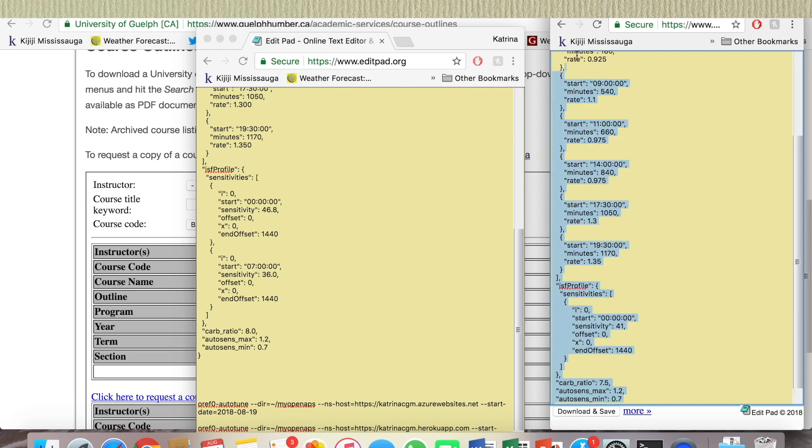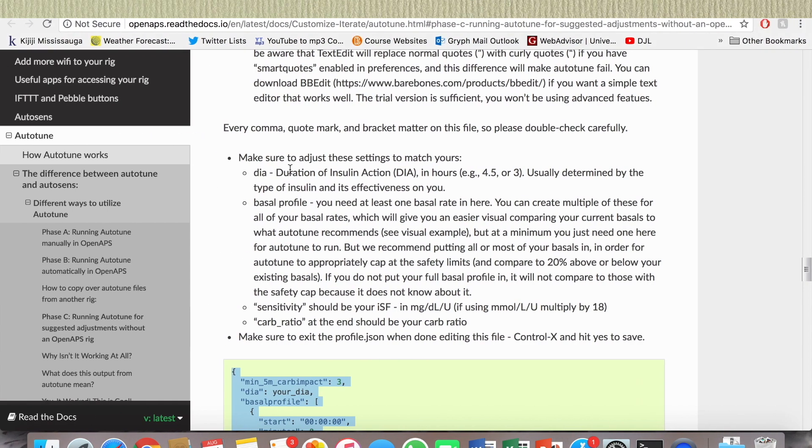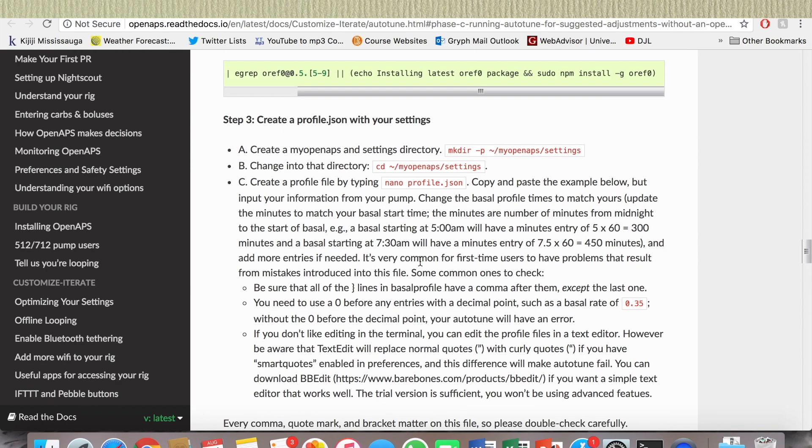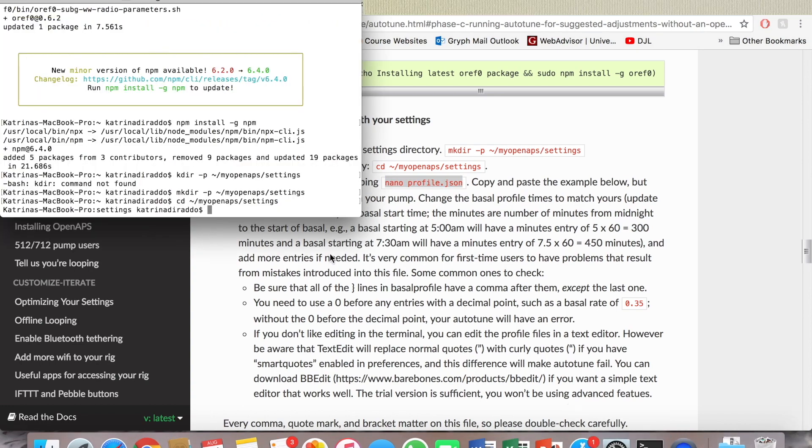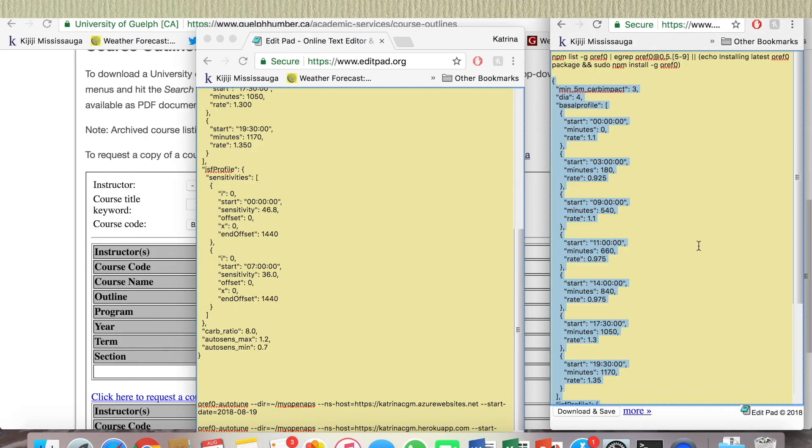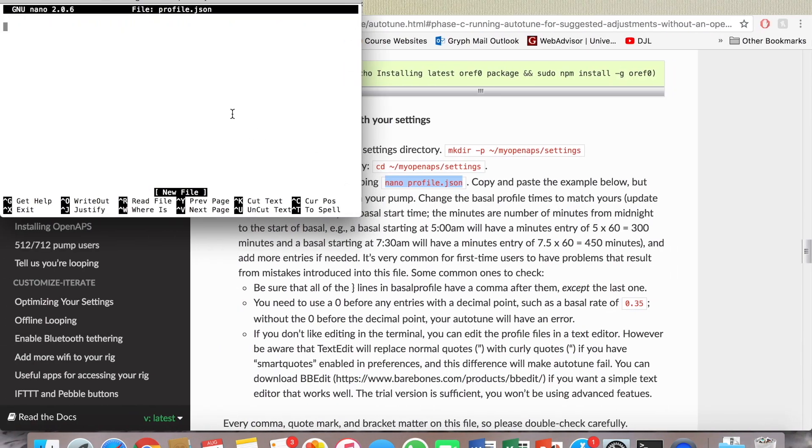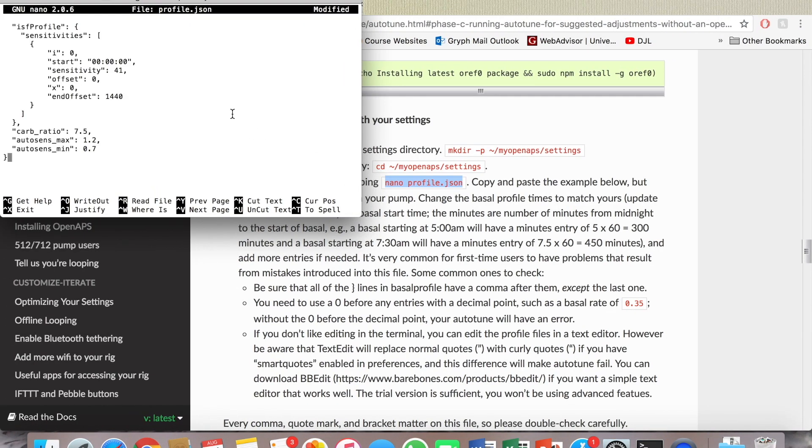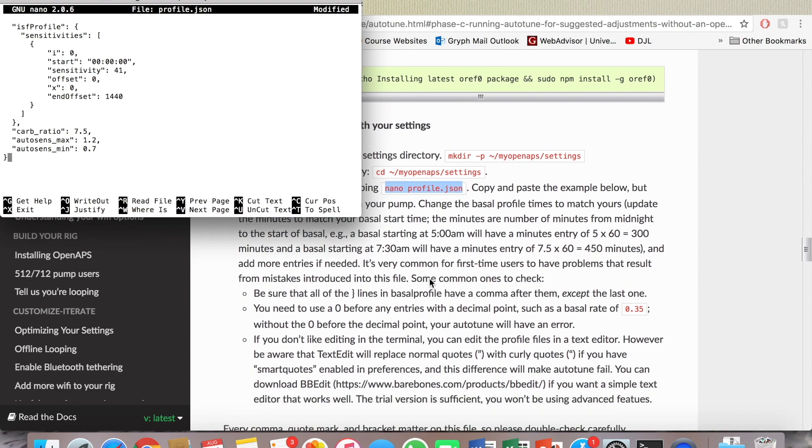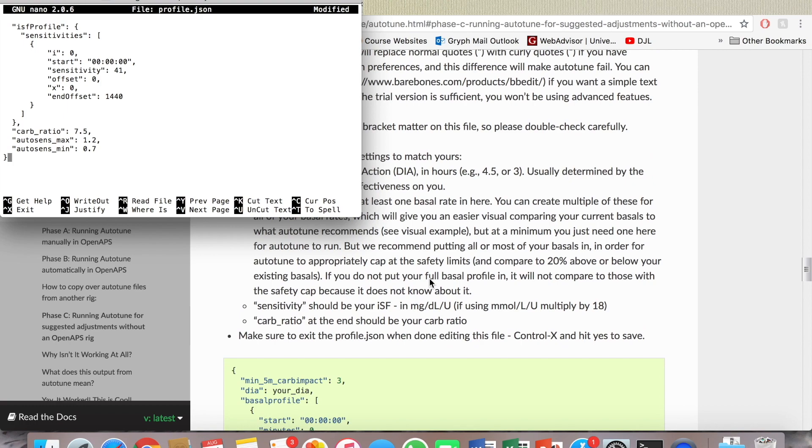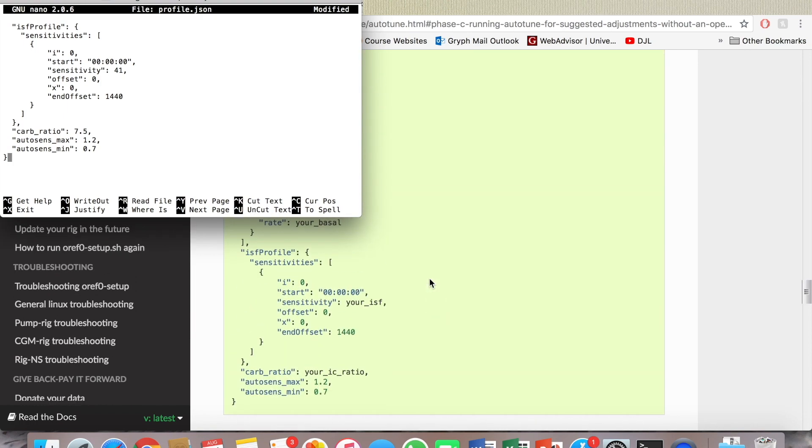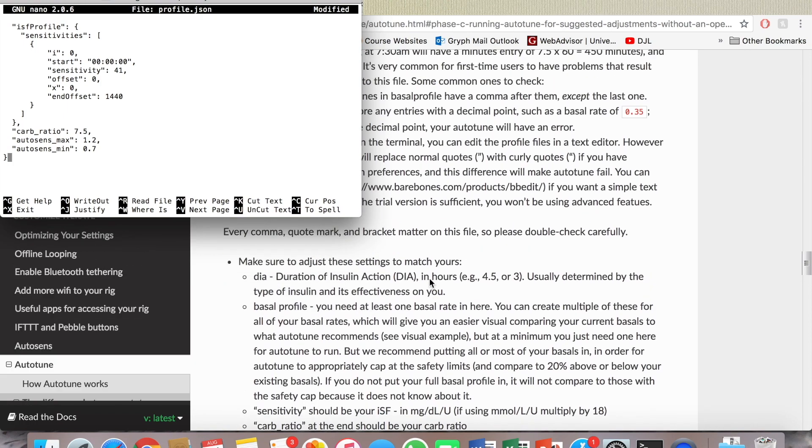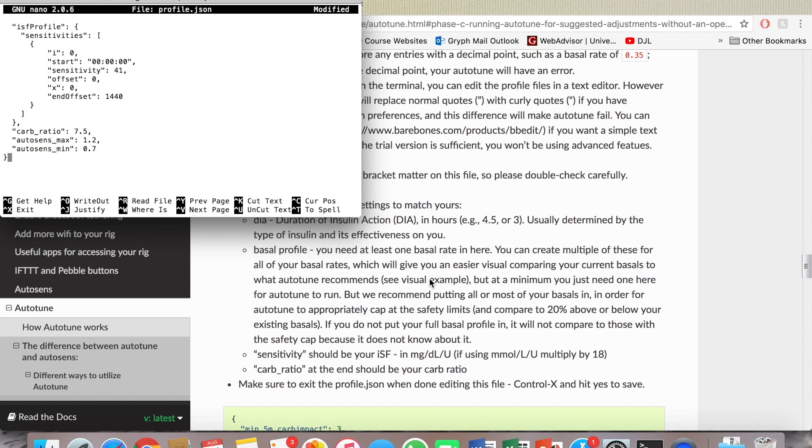So copy this. Oh, not copy it, because now I have to put in this first. So copy this to terminal, and this is where I'm pasting this. Okay, so now I'm supposed to paste, I'm supposed to do after. Make sure to exit when I'm done, so control X and hit yes to save. Okay, so now I'm done that.